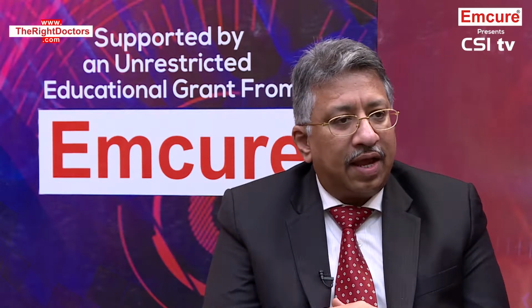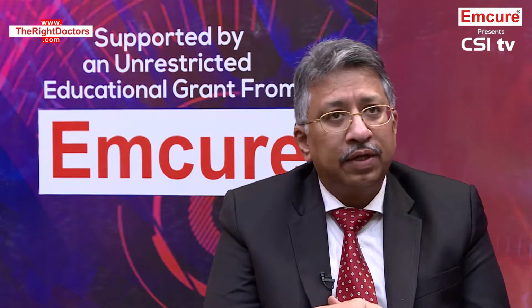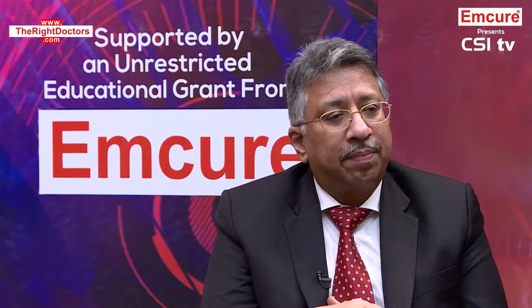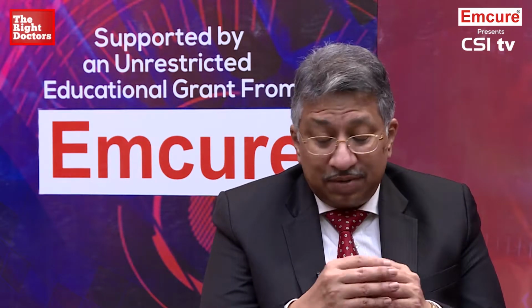Right, sir. So, sir, according to you, what will be the place for IVUS? Intravascular ultrasound has now come out to be a very important imaging tool, and these are imaging tools that are primarily used to optimize stenting. In the left main, IVUS is absolutely essential to find out if your stent has been apposed well, if your stent has left any dissections, if your ostium is well covered. It helps in 3 areas, if you look at it basically.